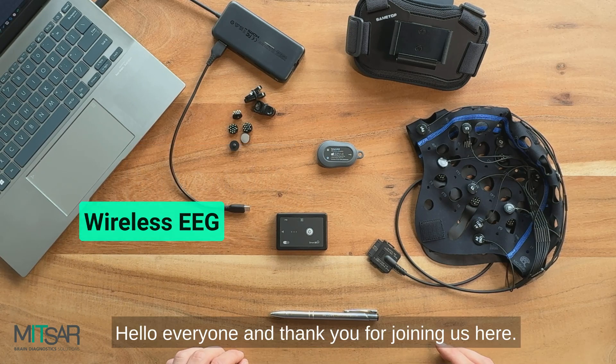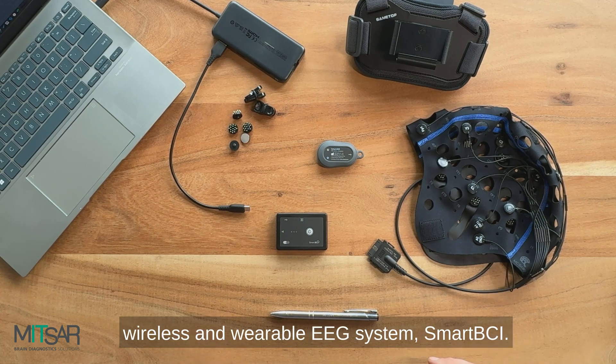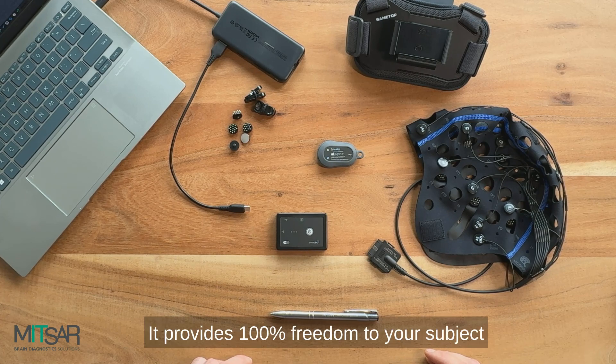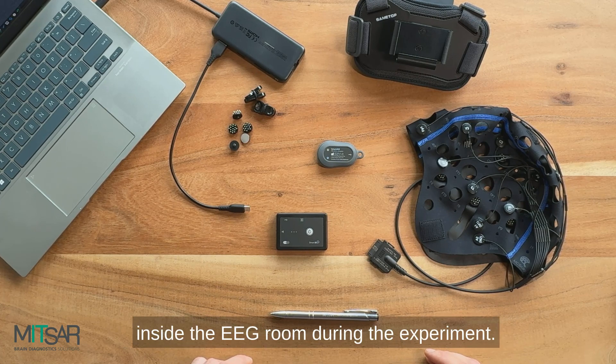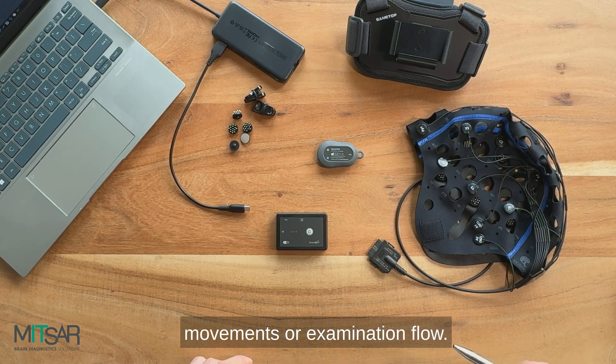Hello everyone and thank you for joining us here. Today's video is a quick overview of our wireless and wearable EEG system, Smart BCI. It provides 100% freedom to your subject inside the EEG room during the experiment. No more wires hindering patient movements or examination flow.